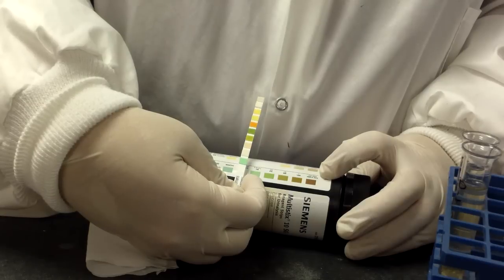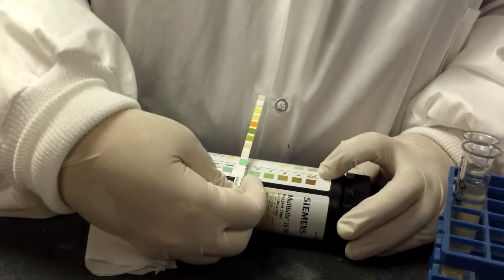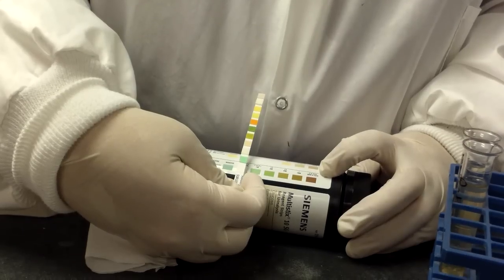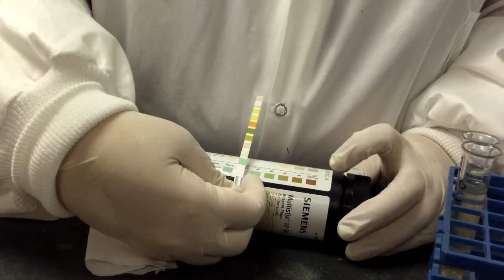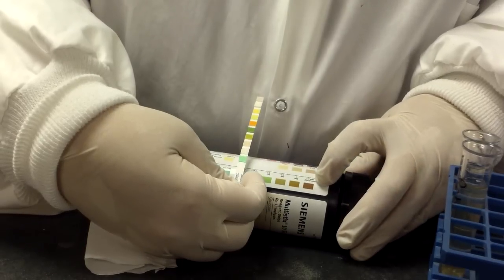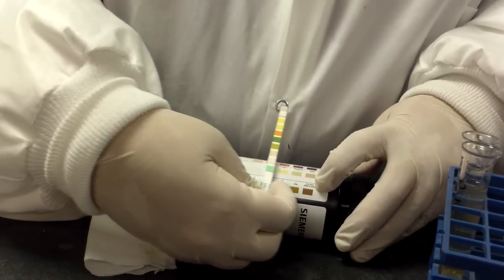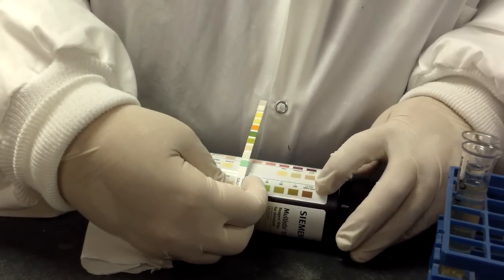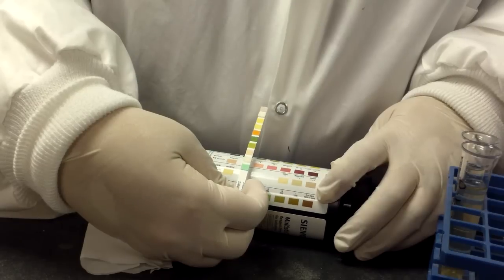There are two scales on some of these. You're going to use whichever one your instructor or your employer tells you to use. So at 30 seconds, we're going to read this one. Then we'll line up the bilirubin, which is the second one. Then we'll line up the ketones.